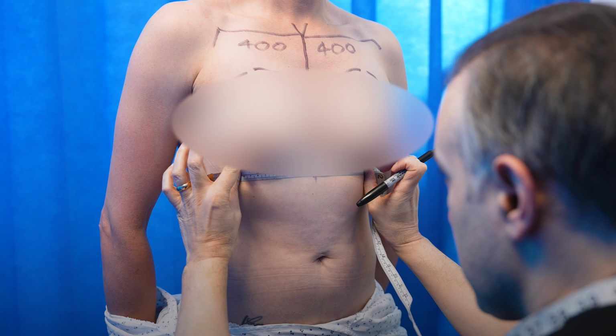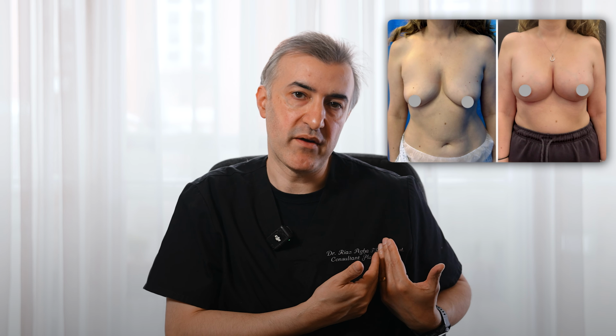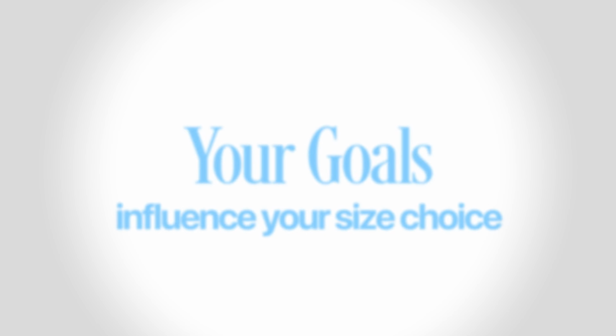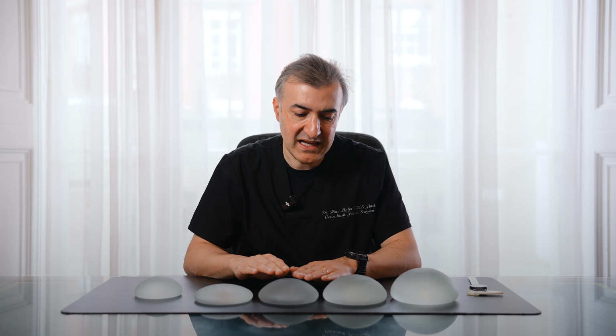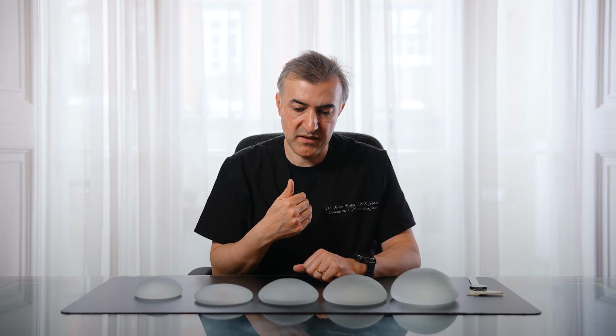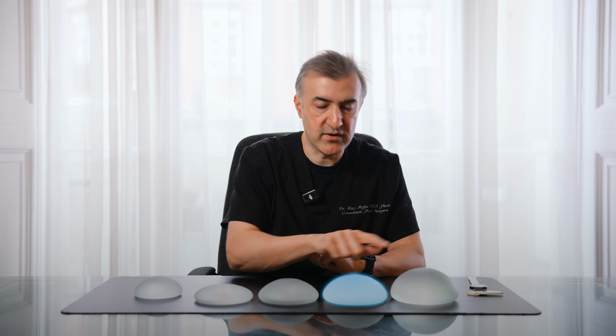So for example, if someone's got very thin soft tissues, you may want the breast implant to be a bit bigger than 1 centimeter less. You may also look at how much cleavage they want, or whether they want a very full lateral aspect. So this is where talking about the goals helps to influence the size that one chooses. Once you select a particular width of breast implant in accordance with the breast width and that calculation that I've just mentioned, you then have a number of different projections.